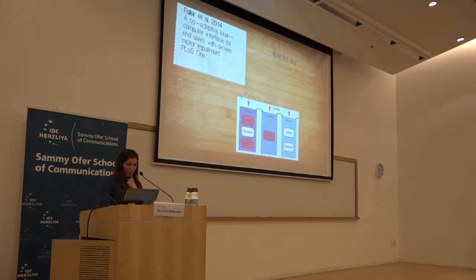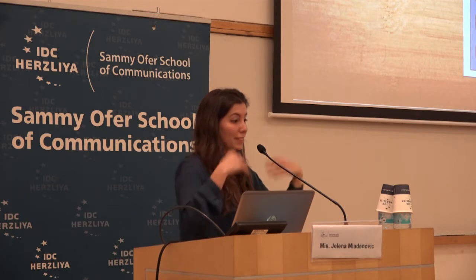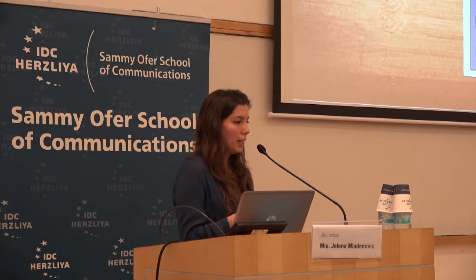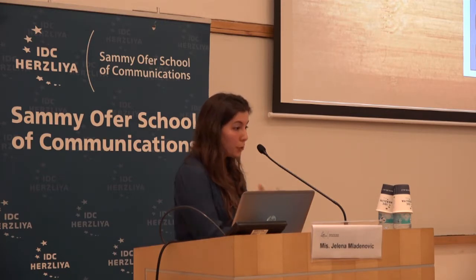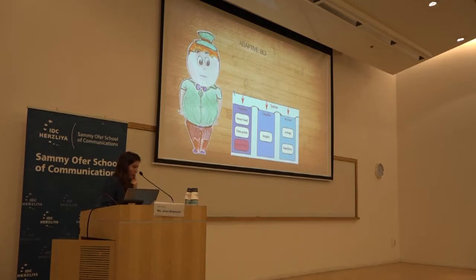So there have been works to adapt the system, which is, for example, to filter different power bands, to adapt the power bands and take into account different spatial filters, and also then dynamically update the classifier during one experiment. That was for motor imagery, and also there are many works on, for example, ERPs. However, they are trying to adjust to the signal variability. They are actually fixing the effect without really considering the cause.